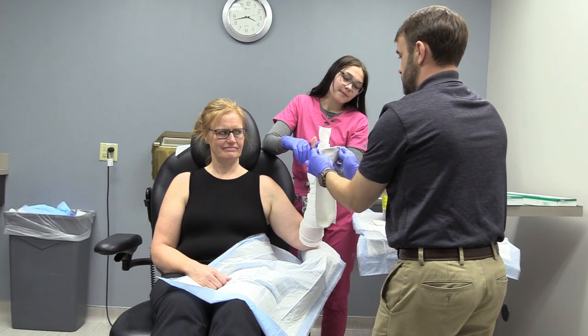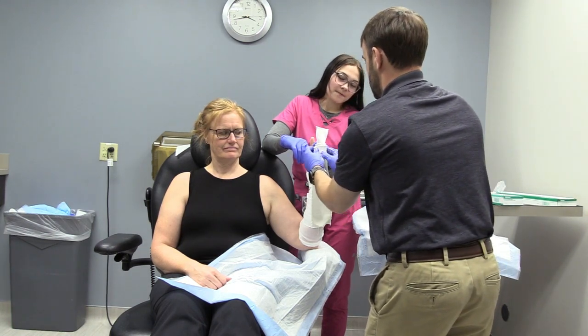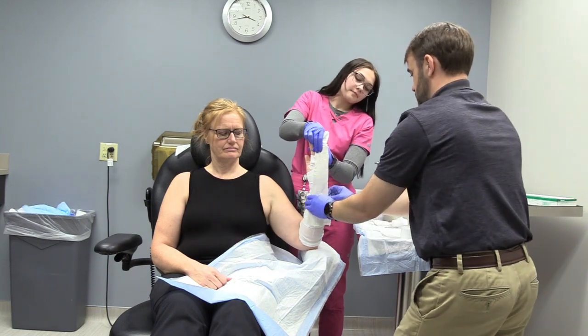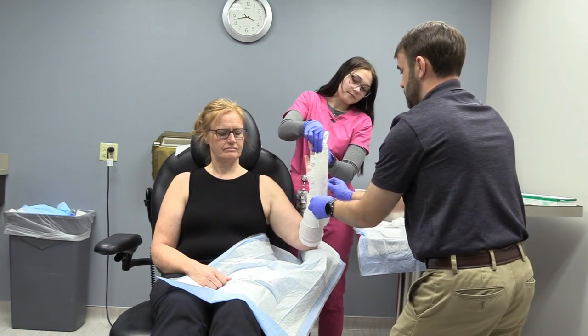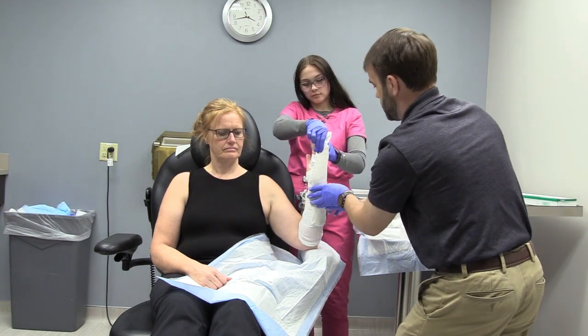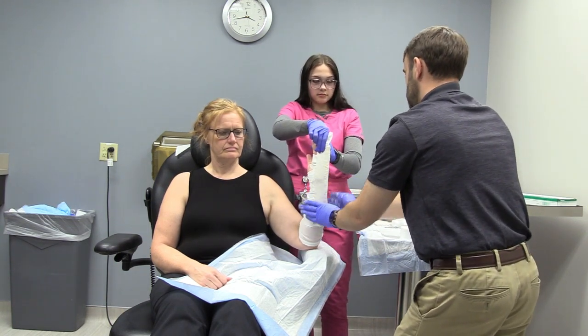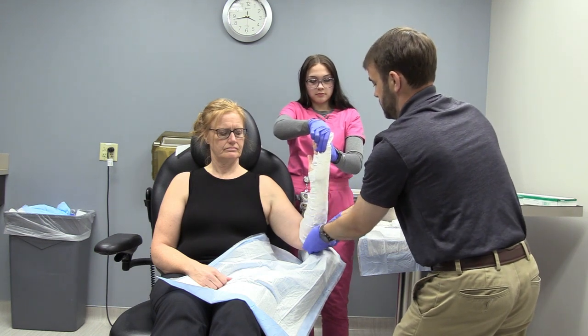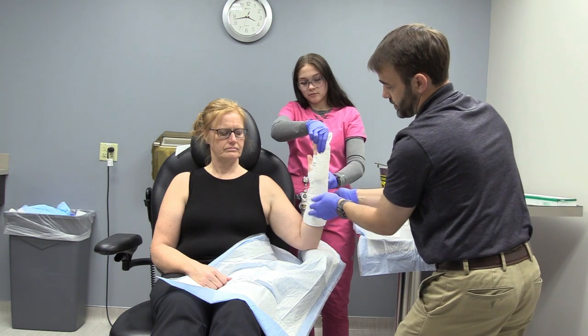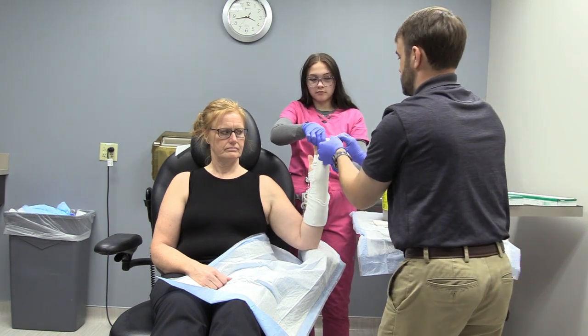Then for this one, you want to just make sure you get enough of the finger, wrap it around, and right there, you just kind of bring it along the forearm. Make sure that you've got padding on the end of it. And this is why I leave the tubing grip a little long. If you pull it up over the edge, now you've got the edge covered and it helps secure your plaster.